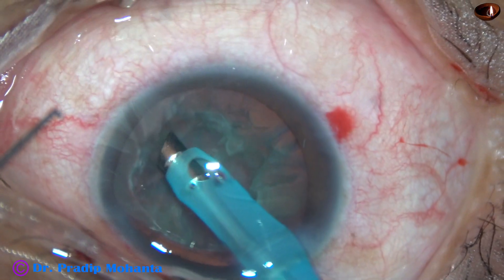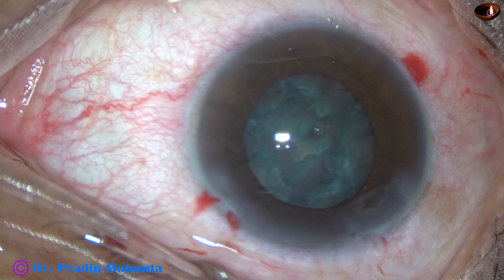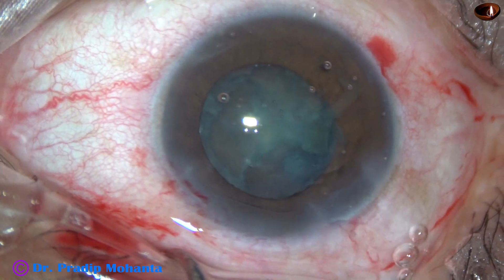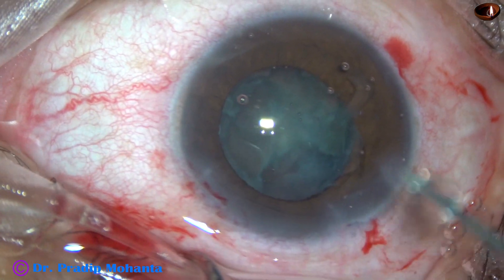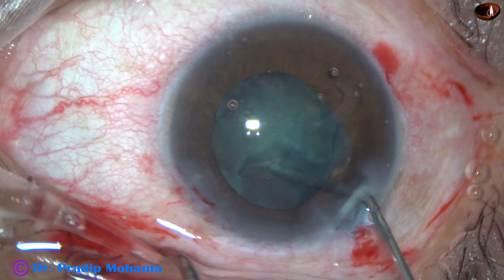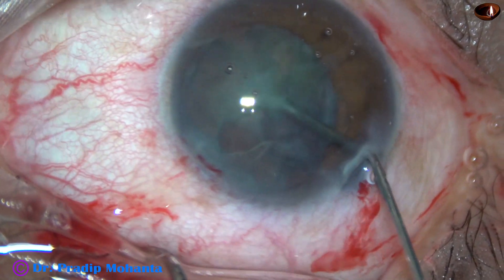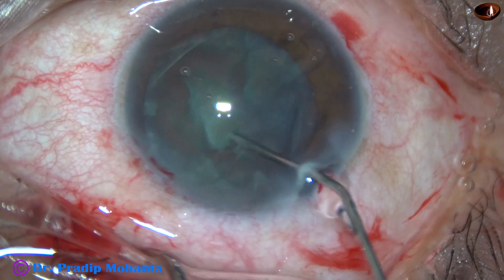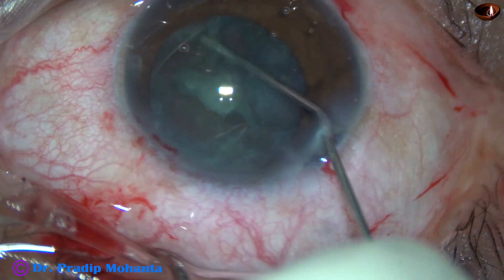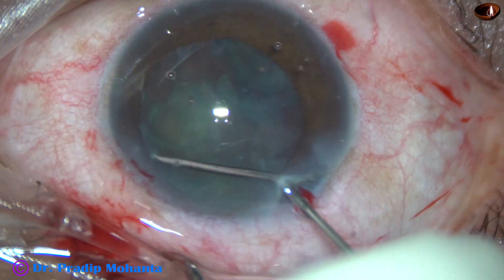So this is the situation — I could not divide the nucleus into two hemi-nuclei. After several attempts, nothing happened. I then did hydrodissection of this nuclear piece, and a few bits and pieces came off.